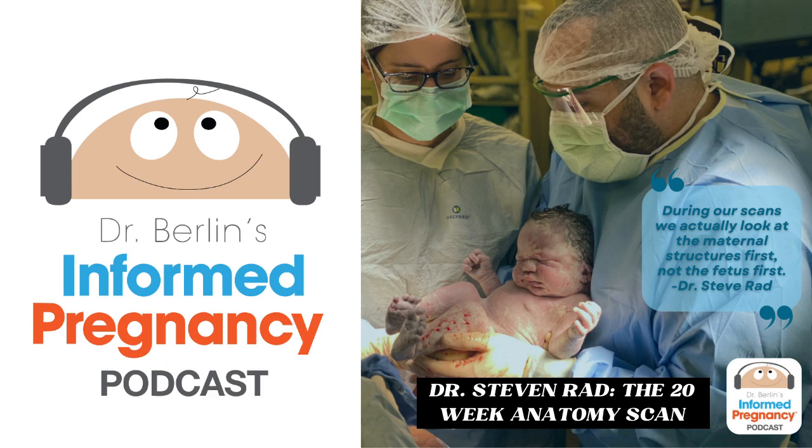Okay. Then I personally, some folks might do it later when they look at the fetal heart, but I check right away what's called the fetal situs. I look at the position of the baby, or fetus, to see if it's head down, or breech, or lying sideways, transverse, and where the spine is. We look to see where the heart and stomach and all the organs are, and we make sure that the heart and stomach are on the left side of the fetal body. So it's called a normal situs. So we make sure the organs are on the correct side of the body. That might be different in other people's protocols, where they look at that when they're looking at the baby's heart and chest.